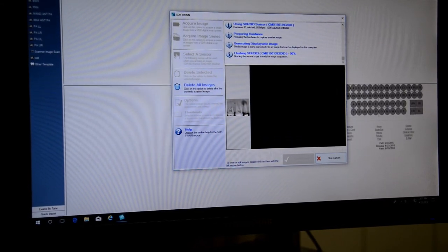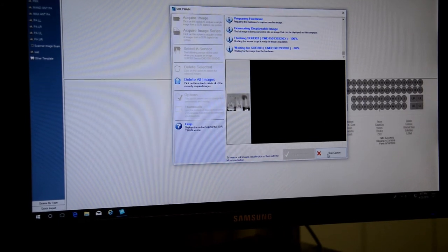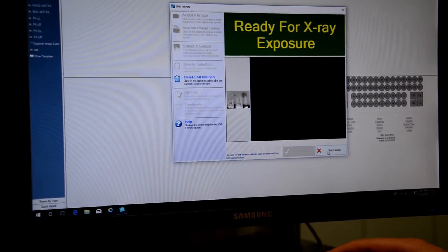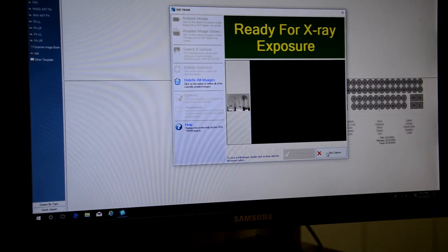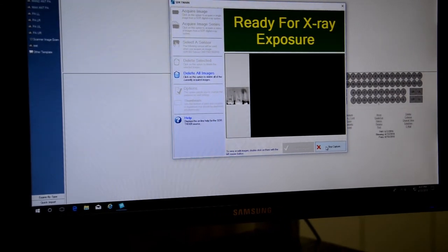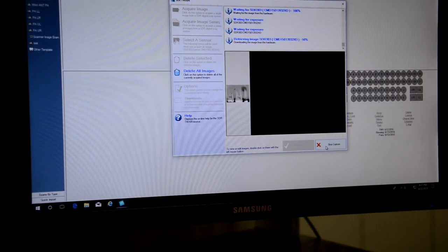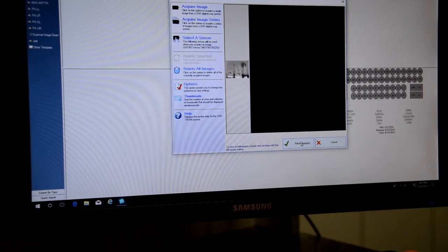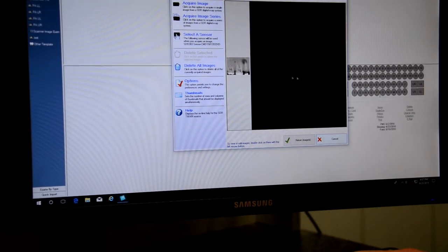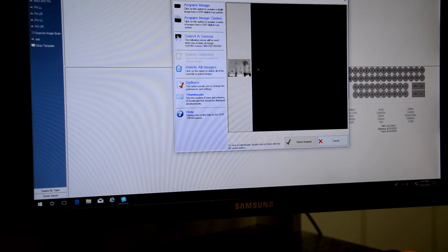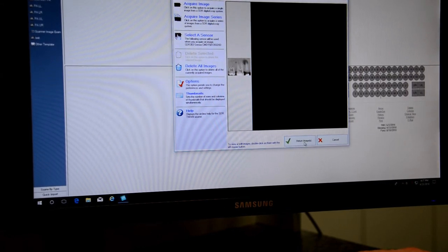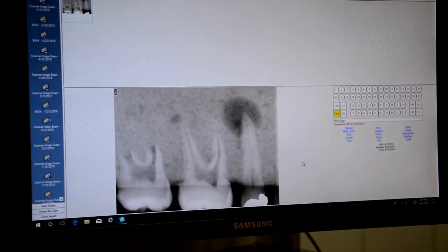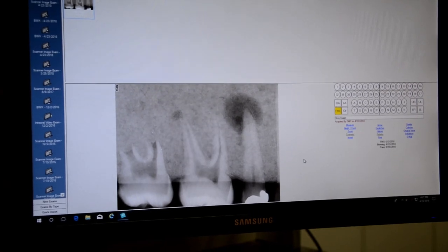Once we're finished we'll click our stop capture. We wanted to take multiple x-rays we could go ahead and take another x-ray. Once we're done taking all the x-rays we want to take we click stop capture and then click return the image. If you had certain images that you did not like you wanted to delete one out, you absolutely could do that. Click return image and it's going to save the image right into EagleSoft imaging.